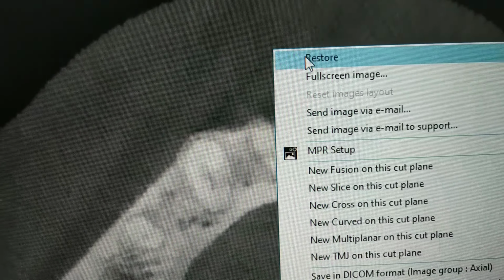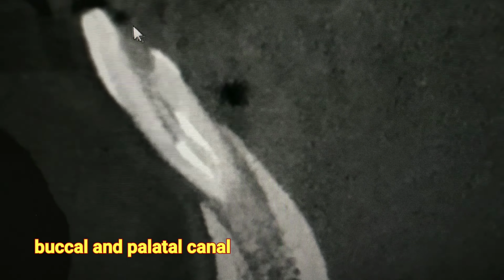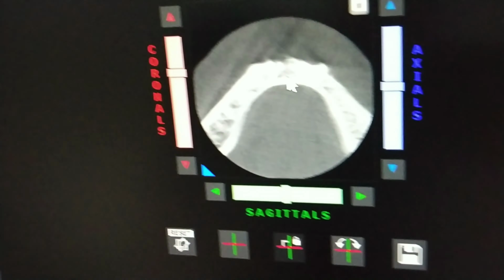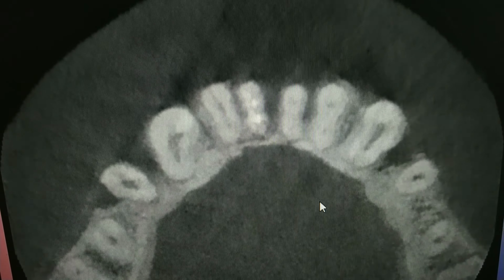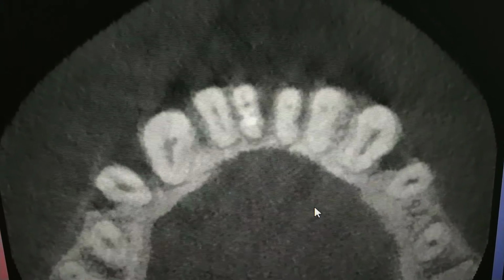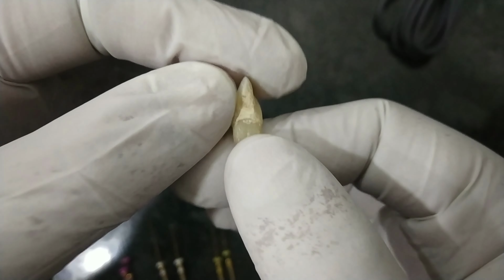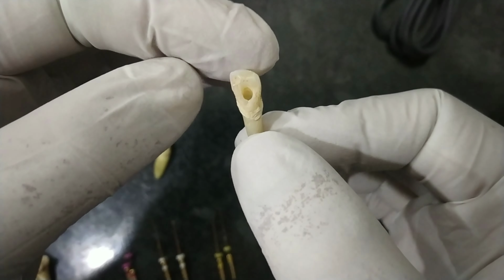This is the axial section. These are the two canals of the lower central incisor. We can clearly appreciate this is the access opening point, and the two canals are getting divided like this. You can see there are two canals in the lower central incisor tooth.